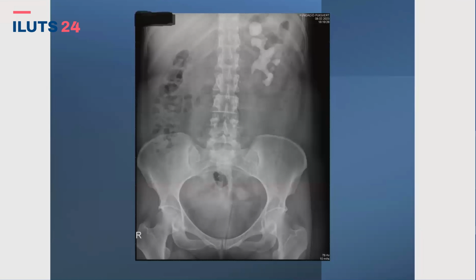What we saw in the past is that this kind of stone actually, it's made of many, many small stones. And they can evacuate only by leaving a nephrostomy. So it will take time. How you reach the diverticulum through a PERC track? It is too high. I think it is.